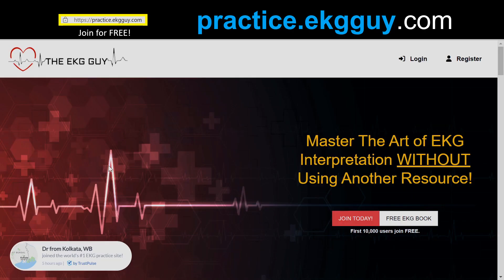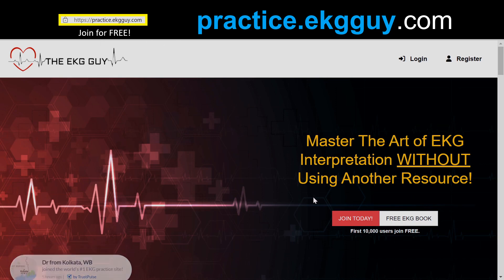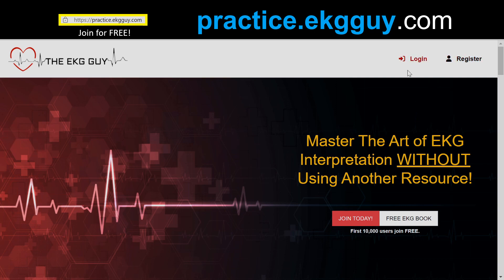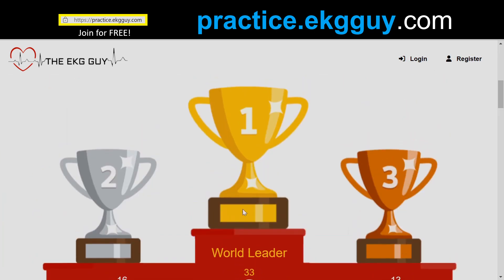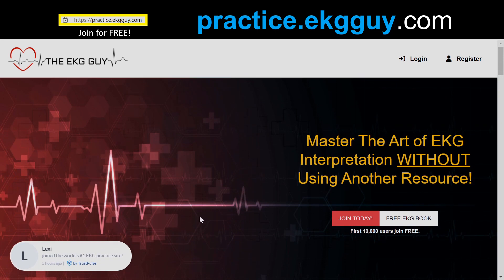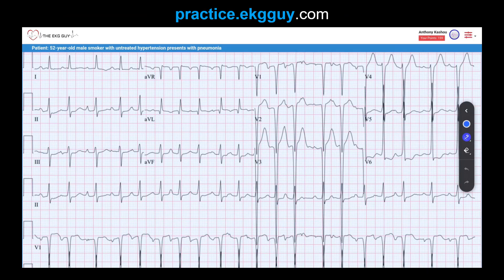You're probably on our free practice site at practice.ekgguy.com. Register there and you can start to climb our leaderboard and get practice. Let's go to our question to review. Here we have an ECG obtained from a 52-year-old male smoker with untreated hypertension who presents with pneumonia. The ECG shows an irregularly irregular rhythm with three or more different P-wave morphologies.